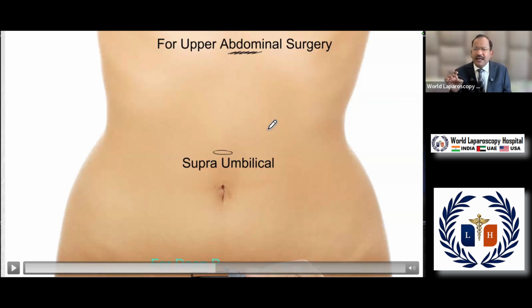So, only diagnostic laparoscopy and simple gynecological procedures like a simple small ovarian cyst, cervical cerclage, simple endometriotic fulguration, and LAVH, laparoscopic assisted vaginal hysterectomy, because in LAVH you do not have to take the uterine artery, you do not need colpotomy, so you do not need cranial traction. In those procedures, you can use the umbilicus, but in all the advanced procedures, you have to use supraumbilical.